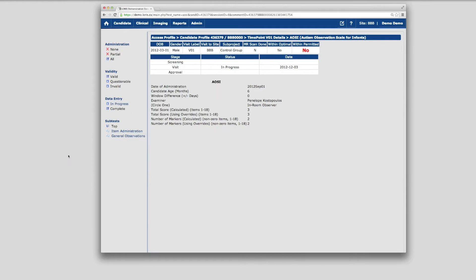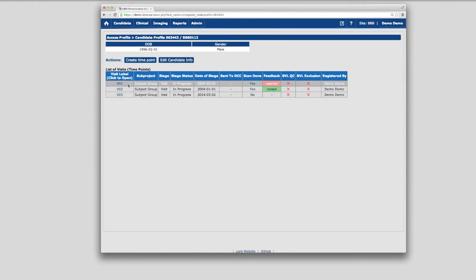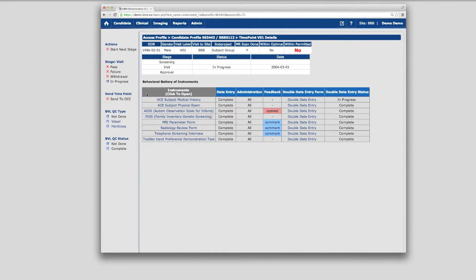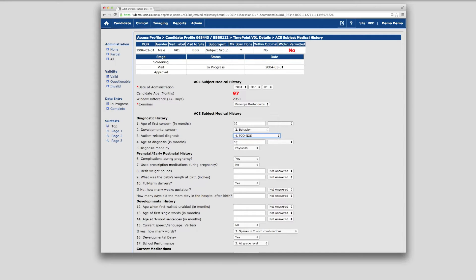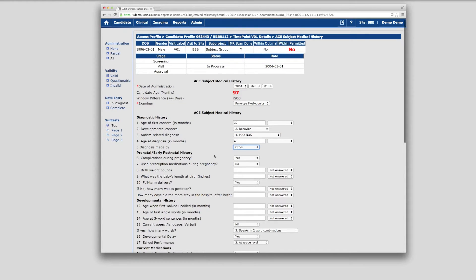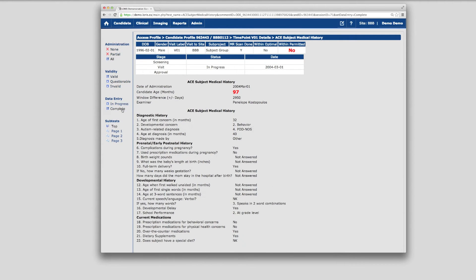LORUS also provides the ability to perform double data entry, which is the practice of entering each instrument data set twice in duplicate forms. Double data entry is highly effective for reducing the risk of errors in manual data entry. Once data entry is complete for a given instrument, the next step is to review and resolve any discrepancies using a special tool called the Conflict Resolver.